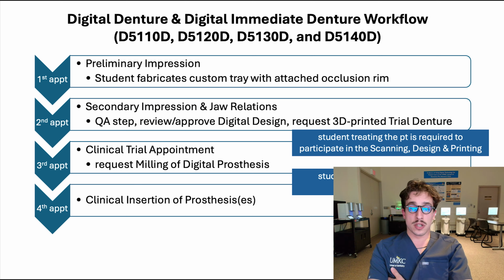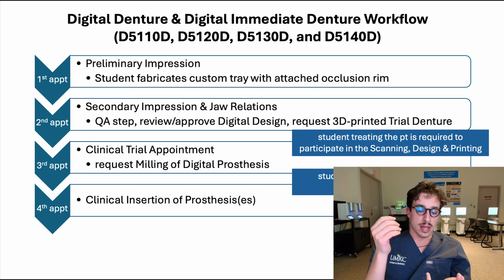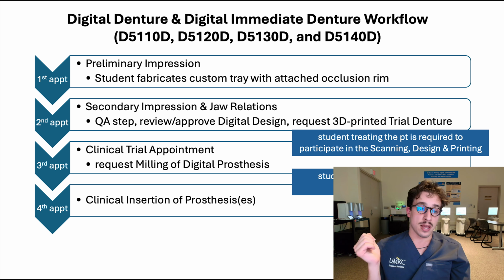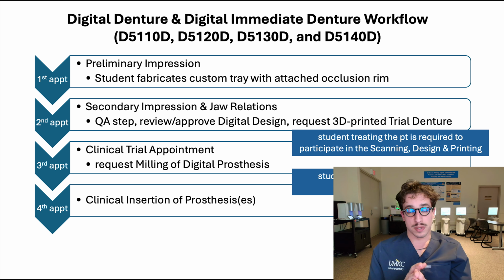Now, one of the things I want to stress is that I've said it multiple times by now, but for each of these steps where you'll be involved with it, which will be scanning in the wax rims, scanning in the try-in if that's needed, if we make significant changes, being there for 3D printing the try-in dentures, and being there for milling the final denture, there are videos on this playlist that cover all of this explicitly. So what you need to do is, like we said, there's a trade here that you don't have to set teeth, but you do have to watch these videos before you come up to do it with either faculty or TAs or staff. And it's really important that you do that. And we will be testing your knowledge just to make sure that you have watched it.